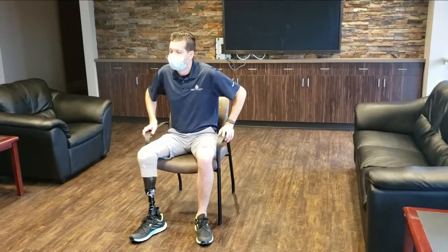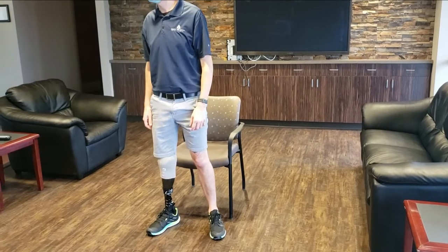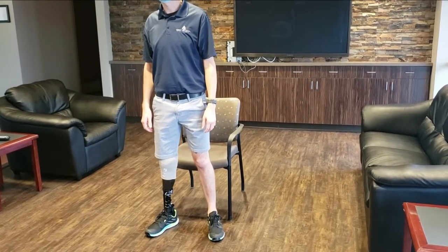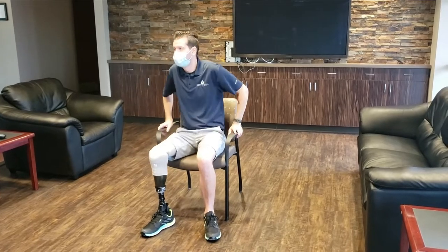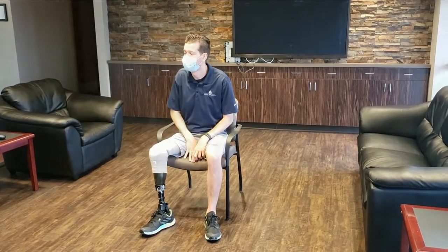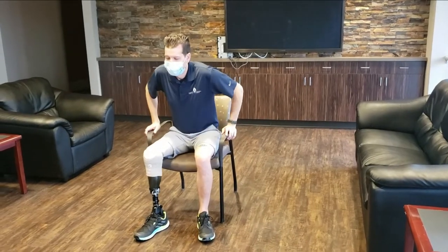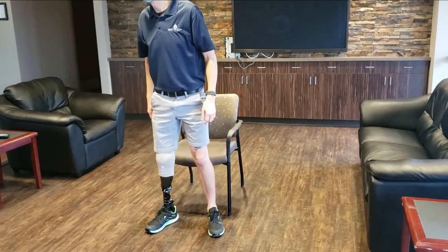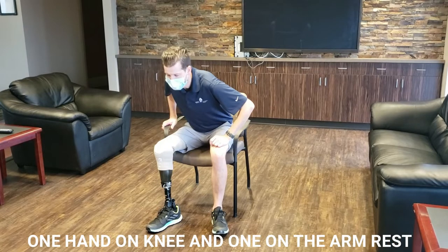When you are now trying to do this without a walker, notice how he scoots out more forcefully to the end of the chair and he leans forward with his trunk pretty assertively. When you lean forward with your trunk, that allows you to get your bottom up off the chair more easily. In this case, he's using his hand on his knee to stand up and the other hand on the armrest.